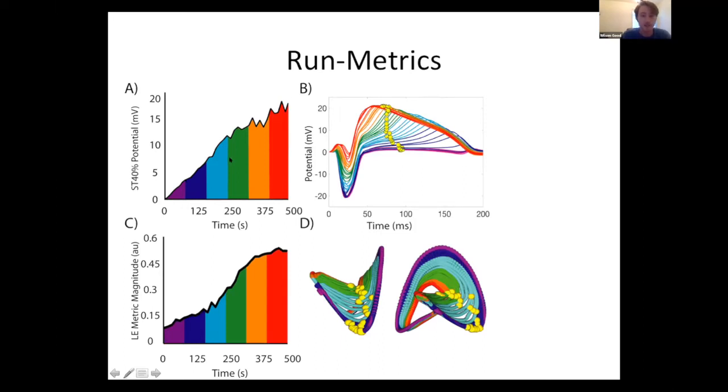And just so, this down here is a manifold generated from some machine learning algorithm that sort of distills all of the beats captured across all electrodes into this single shape, right? But using this single shape, I can track a single time point, right? I don't lose my temporal progression, right? And these colors are capturing the progression through the episode, and a counterclockwise traversal through the shape is a progression through the beat, right? So it's just the machine learning.